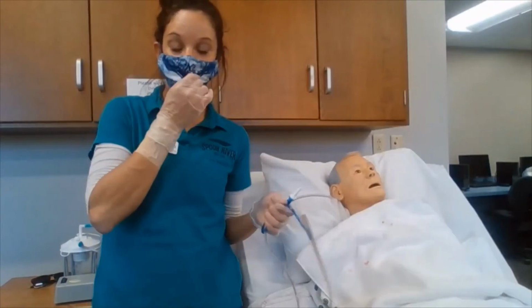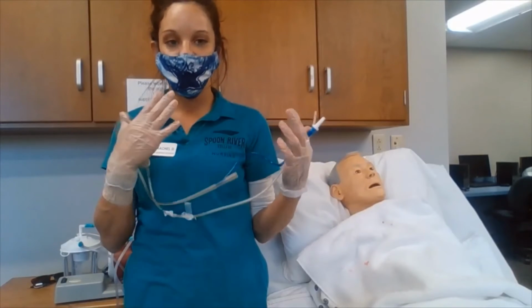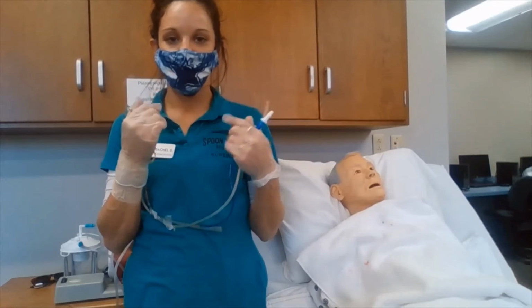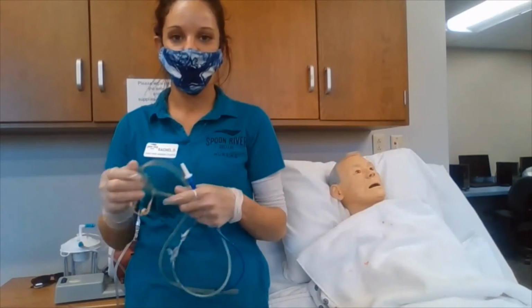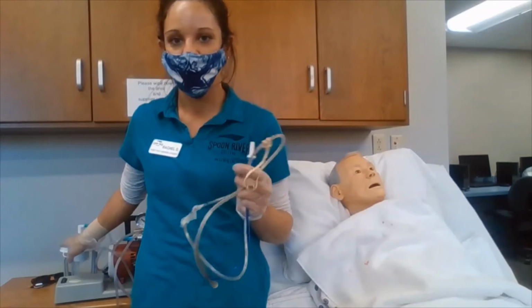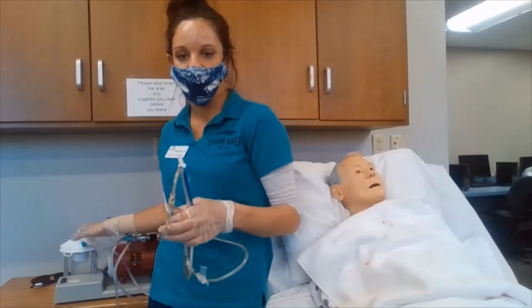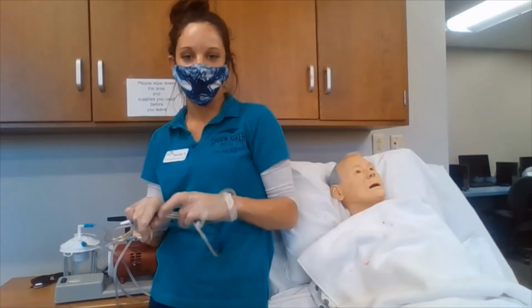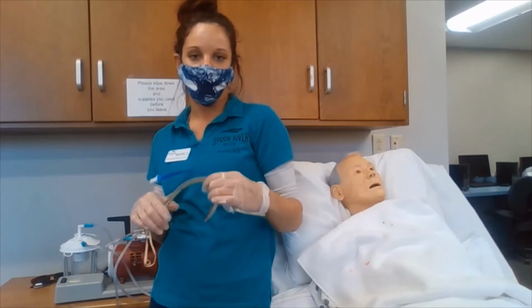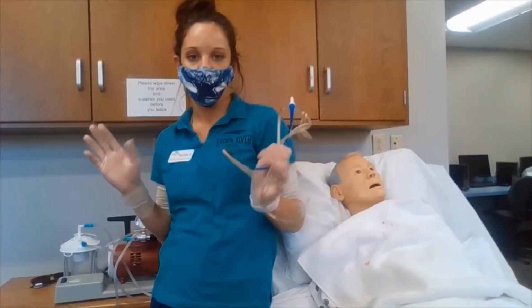If the patient isn't able to do so, we are going to provide mouth care, nasal care. We are also going to be measuring the output of the secretions. We are going to be noting the characteristics of our secretions. And of course, we're going to make sure that everything is disposed of properly. Our gloves are removed and our hands are washed.